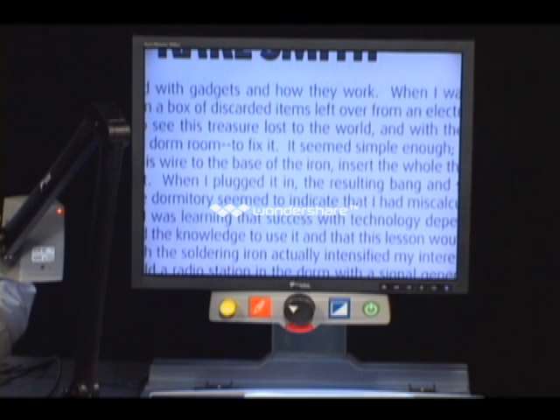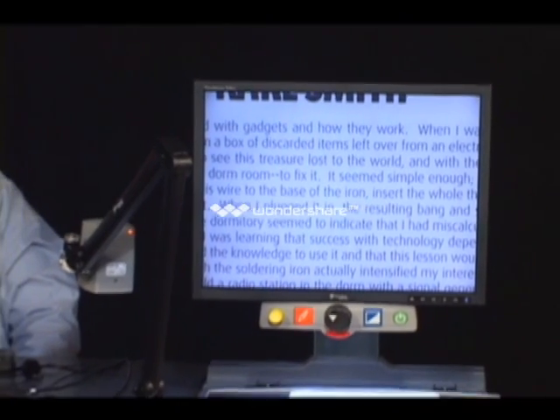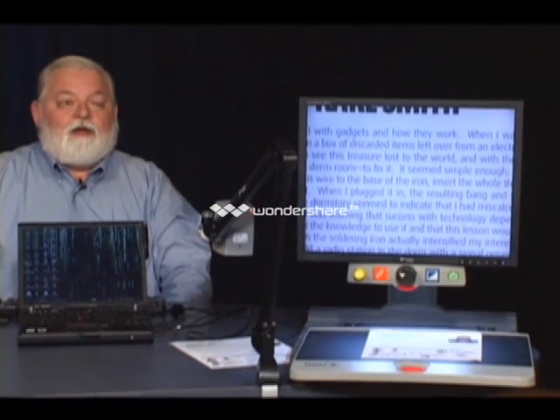Now there are 24 different combinations, and these 6 that they put on here are the most commonly used ones. Now we could turn on all the other ones. We won't do that today, but we could. Some of them are pretty bizarre, and you might look at them and think, good heavens, who wants to read purple on green? Or who wants to read bright red on chartreuse or some ridiculous color like that? You might find that certain low vision people just love it. And if you put that bizarre color combination up there, it is perfect for them to read.